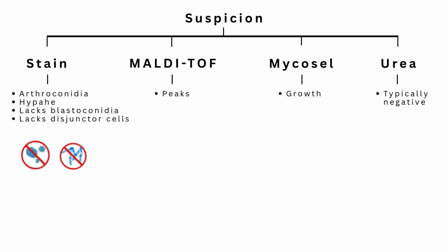This is not a perfect method for identification, as certain species of Geotrichum can be urease positive, so this most likely would be helpful as a supplementary test.